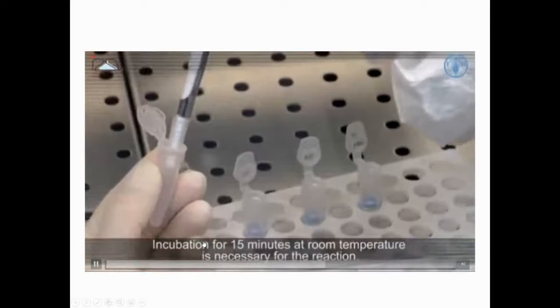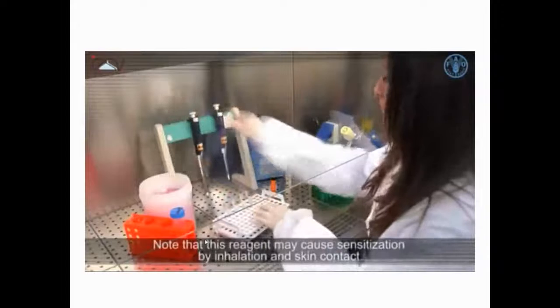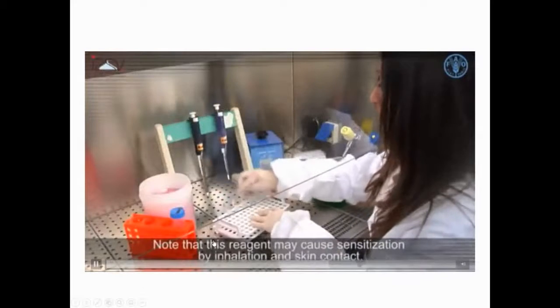Incubation for 15 minutes at room temperature is necessary for the reaction. Note that this reagent may cause sensitization by inhalation and skin contact.